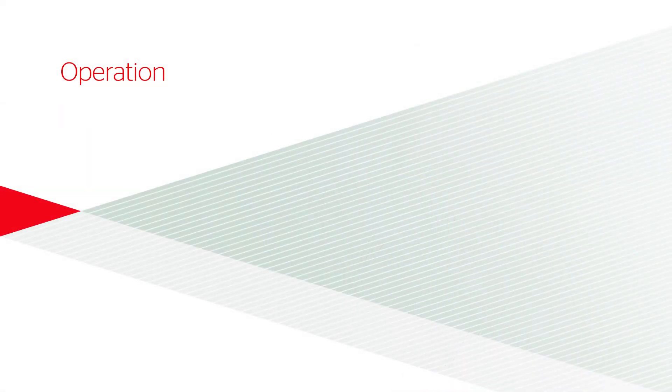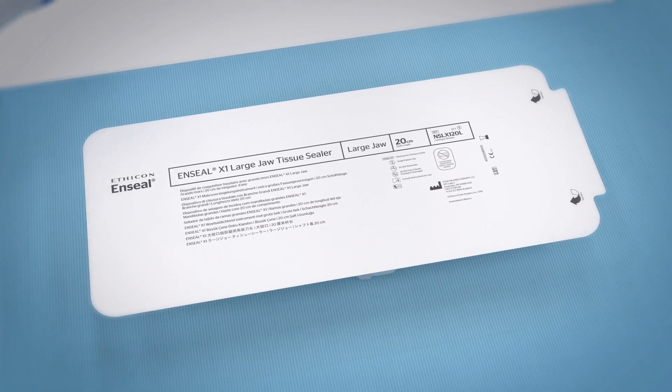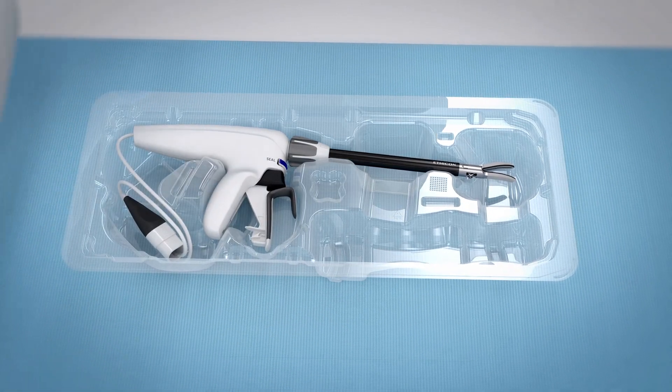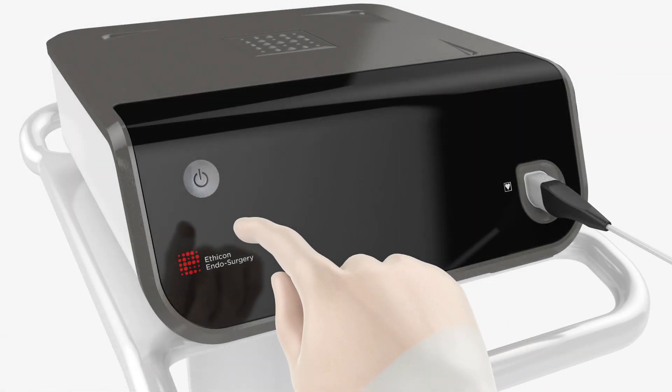Operation: Using sterile technique, remove the instrument from the package. To avoid damage, do not flip the instrument into the sterile field. Connect the instrument power cord to the generator and turn the generator power on.